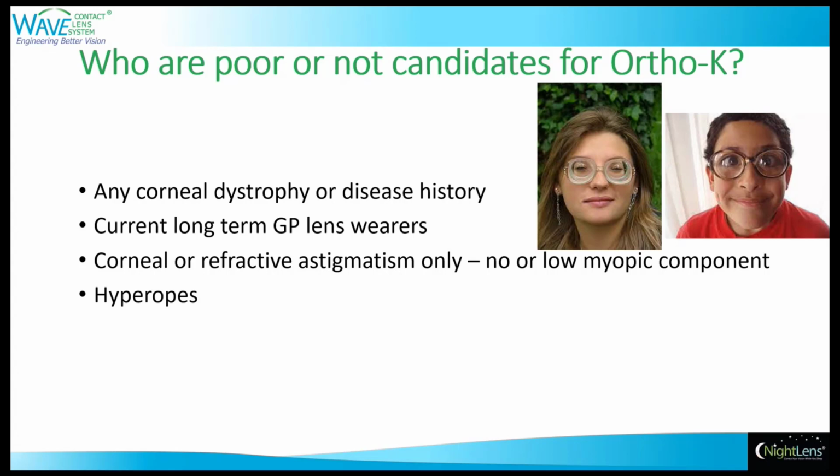Now, I will have to say that this modality is not an overnight FDA approved procedure. So it is something that you would make sure that you have enough experience with myopes before attempting a hyperope.